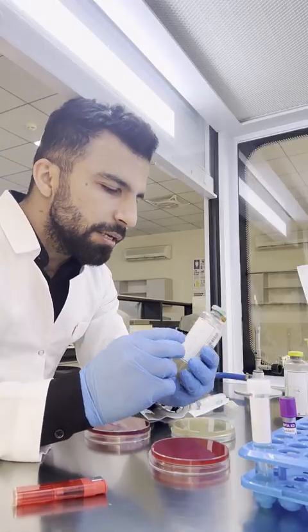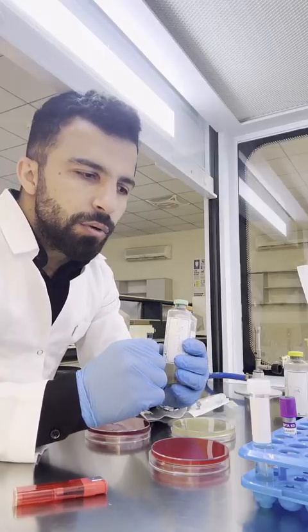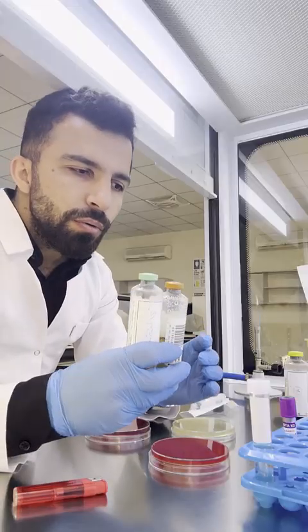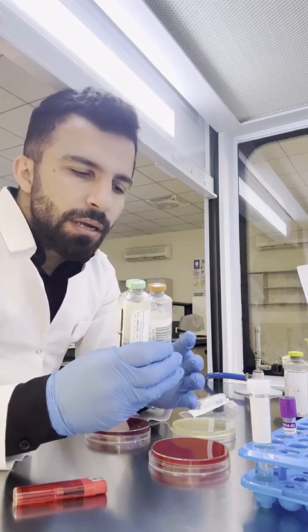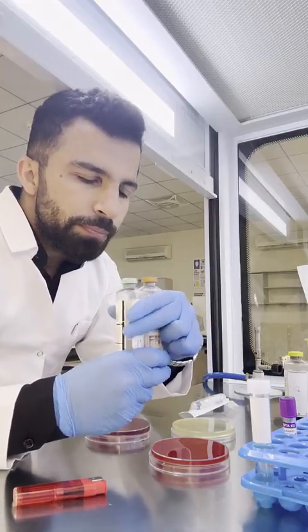And then we have these blood culturing bottles. As we said before, when we culture blood, we need to make sure that there is bacteria present inside the blood. So before we culture it, we are going to put blood into these bottles. We have the aerobic and anaerobic bottles. Aerobic means the bacteria need oxygen, and some bacteria don't require oxygen, which is anaerobic.